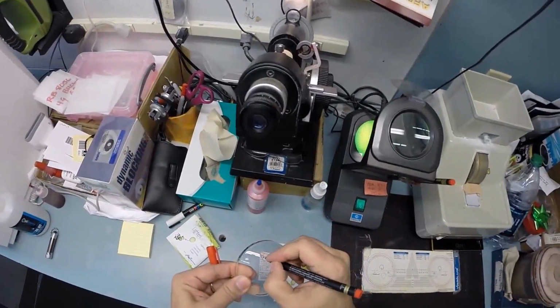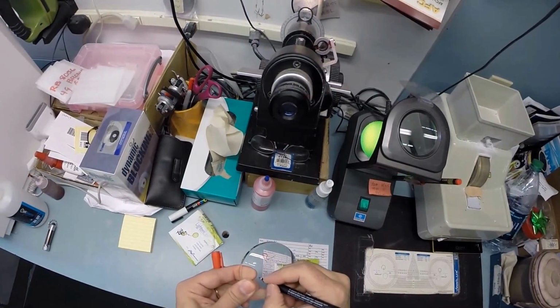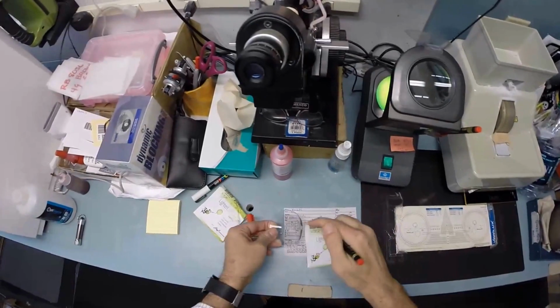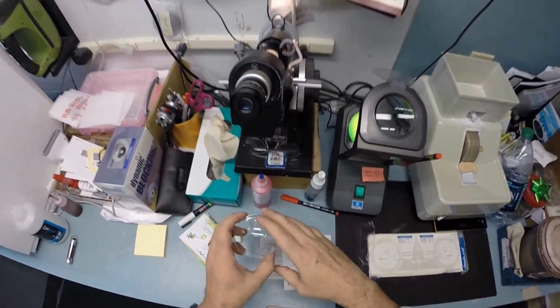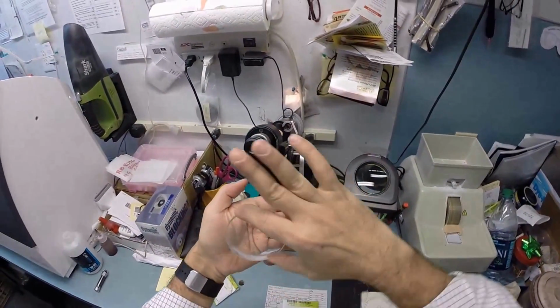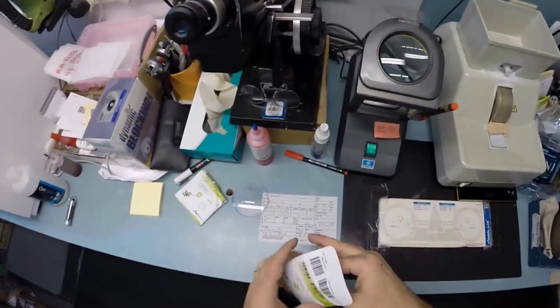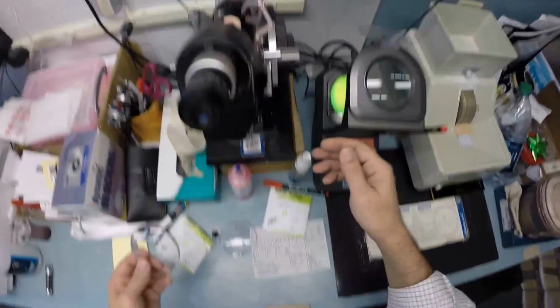I'm going to do everything later. Do I have to do it all right now? And this is your right lens, so I'm just going to mark this R for right. And I put 3 dots on there, and I'm going to darken those so you can follow this at home. What that does is that tells me how to orient the lens just right, because the lens can only go in there one way with your astigmatism correction. Did I mention I was going to explain that later on? God, you want me to do everything now.